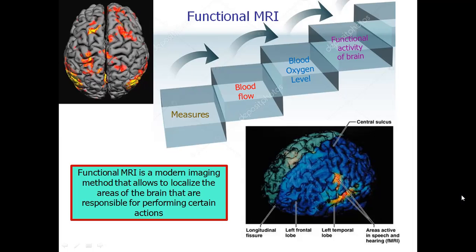Functional MRI is a non-invasive technique for imaging the activation of brain areas by different types of physical sensation, such as sight, sound, touch, taste, smell, and others.